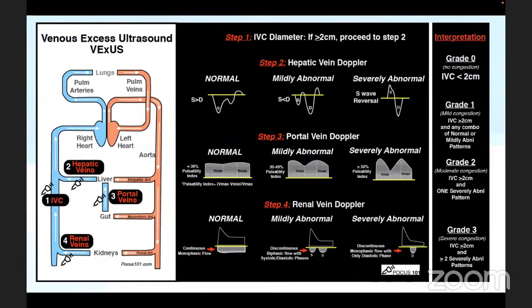Because you are unable to see the main limit. If the congestion is there in the organs, the waves will be visualized, no? As you said, this grade 2, 3, like that. That's what, sir. But I don't know, none of the literature is available till date. We will do that. We will create the literature.